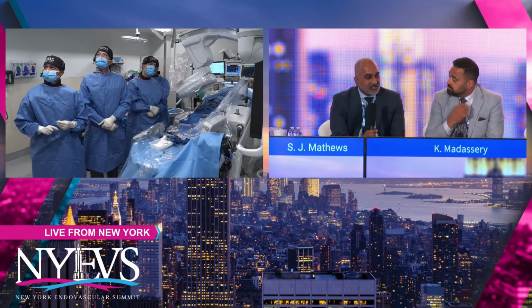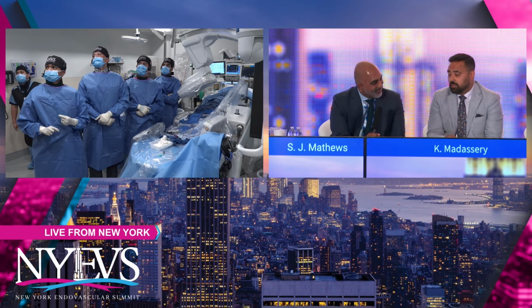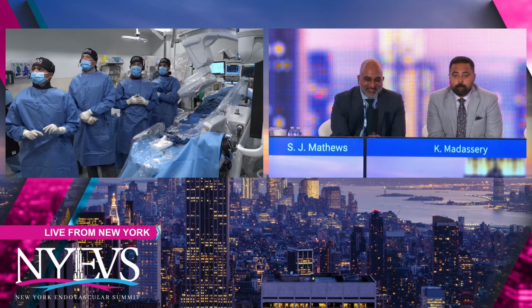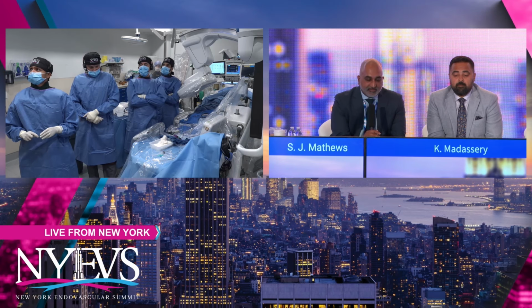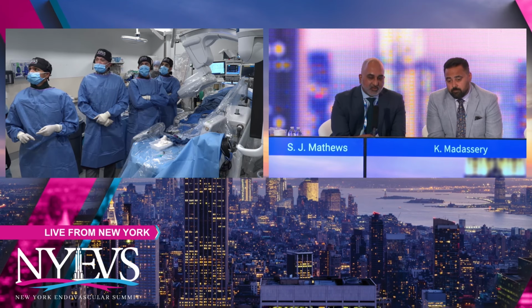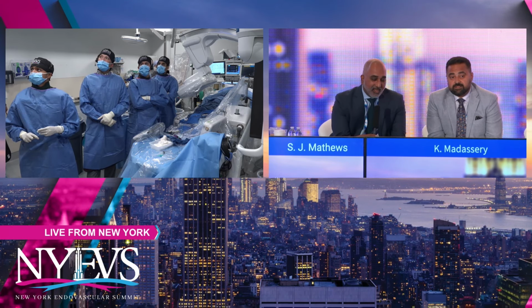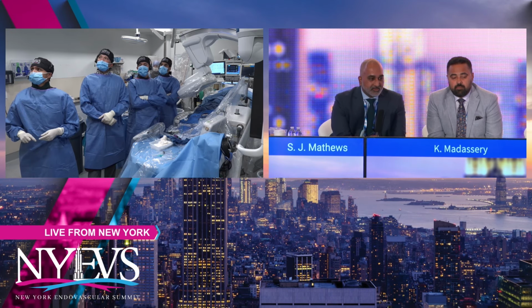Because I found that I've tried for how long? Forever. The full anticoagulation, do you give it for a month, 2 months, or just you're treating your... Yeah. Because the other thing, too, is when it goes down, it's a little bit easier to deal with, because the thrombus is still fairly liquid. I've noticed operatively, it's just an easier clot to manage.